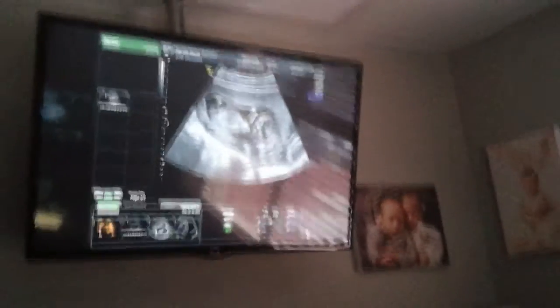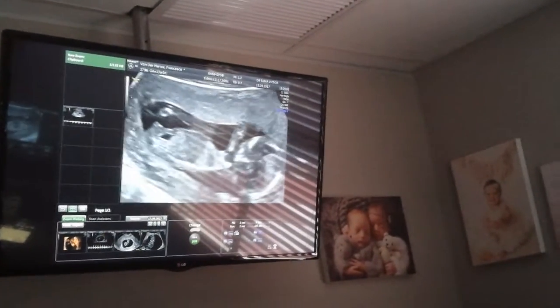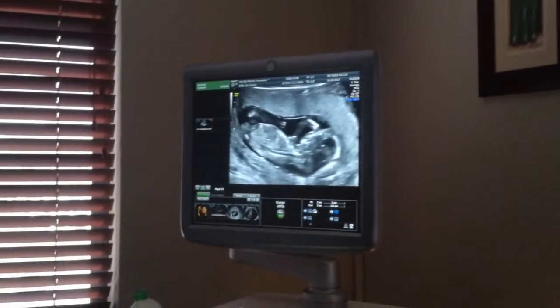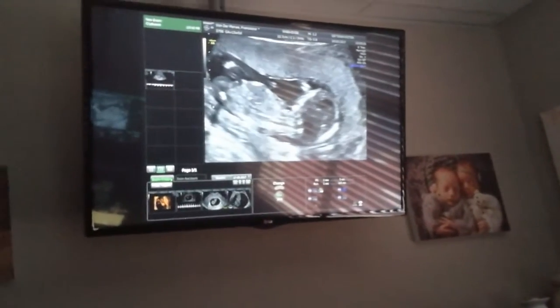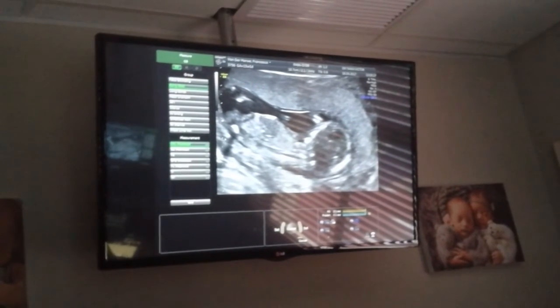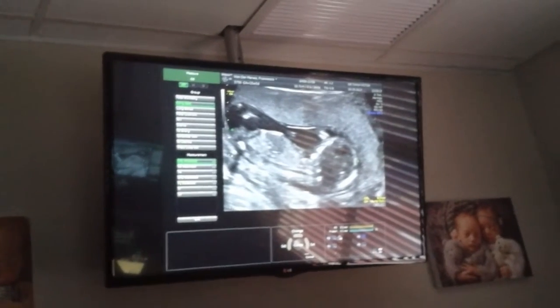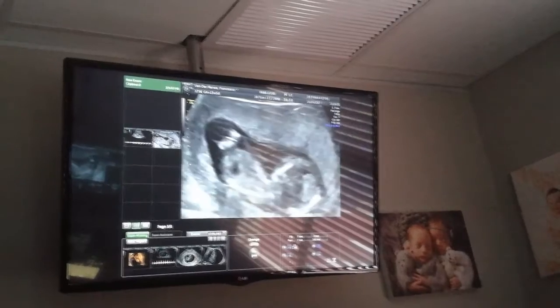Baby's head is on the right-hand side, the bum is on the left. I'm just making it a little bit bigger so we can see what's going on. If I go and measure baby's length — we call it the crown rump length, from the top of the head to the bum — at this stage baby measures 8.2 cm, which is perfect. That's a big one!